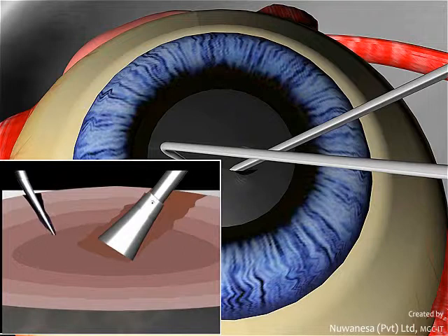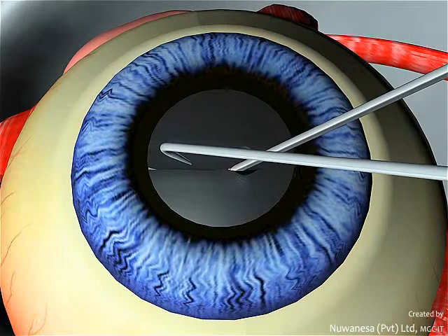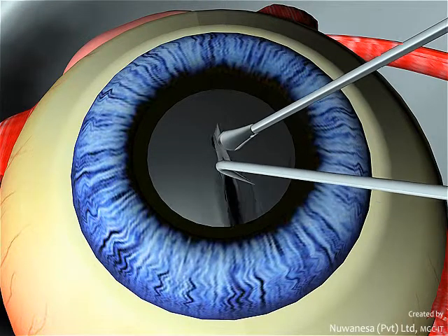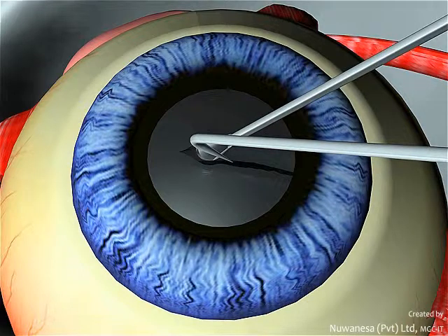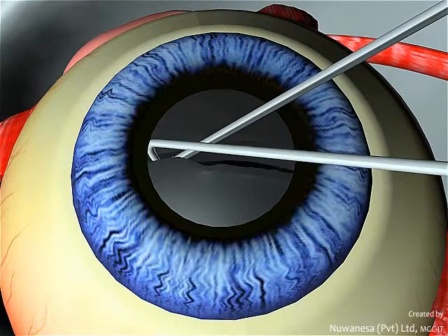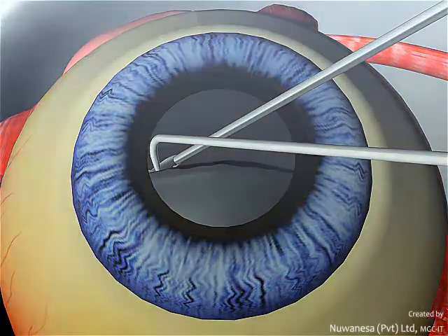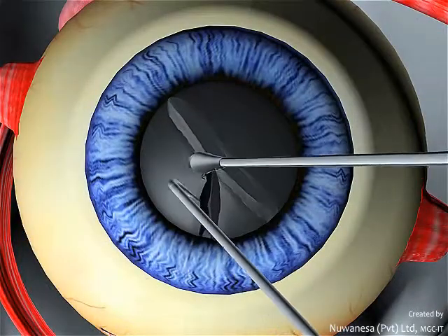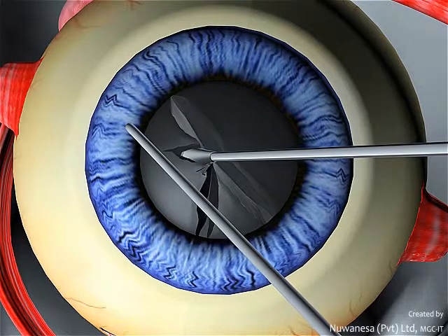Engage the FACO probe at the edge of the previously made hole and a vertical chop is performed. Rotate the nucleus 180 degrees and engage the FACO probe at the opposite edge of the hole and repeat the vertical chop to make two halves of the nucleus. Repeat the vertical chop to make three pieces from each half of the nucleus.